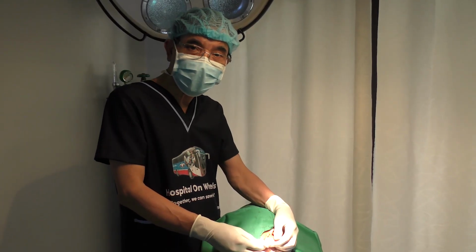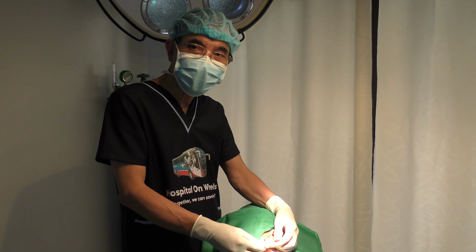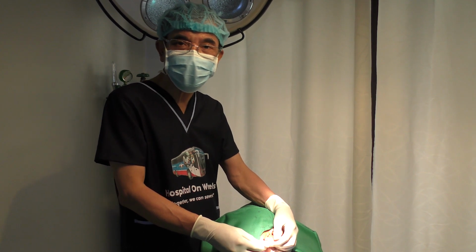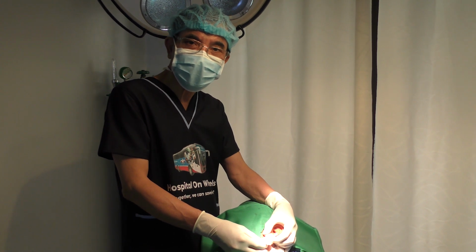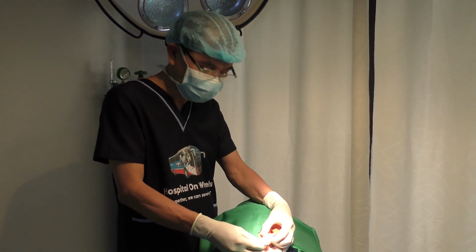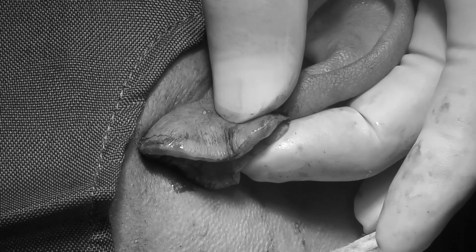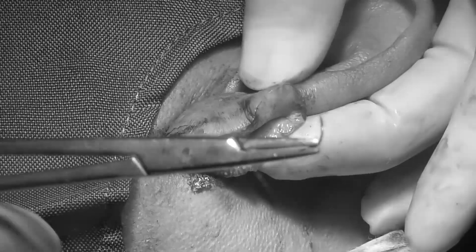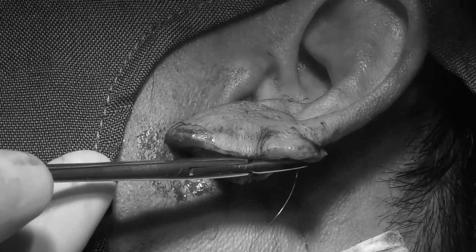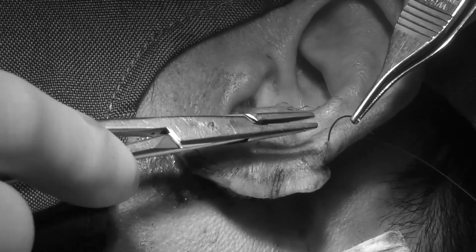Make sure you give an allowance. Don't overdo it. Okay, it's better to be on the excess side than on the side that you are lacking of tissue. Your goal is to reduce the size, and then you can adjust later. Hide the scar at the posterior side of your earlobe.